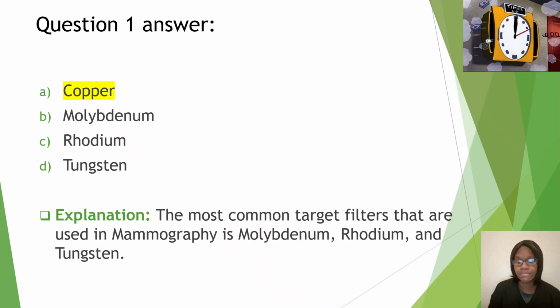The most common target filters that are used in mammography are molybdenum, rhodium, and tungsten.